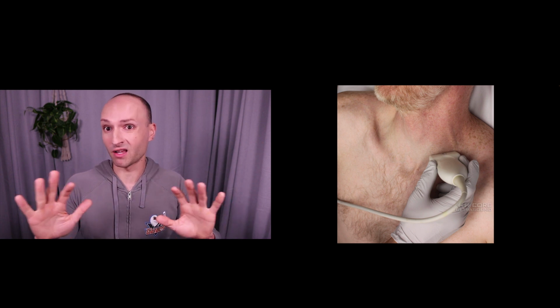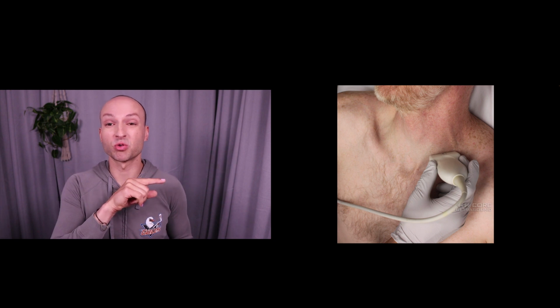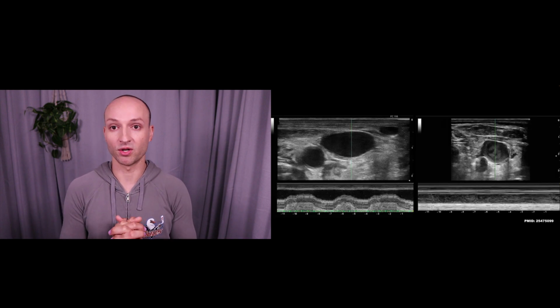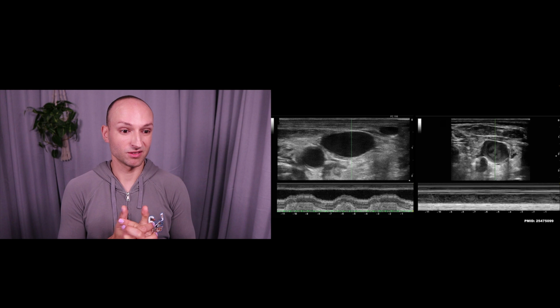There are some studies, though there's not a lot of studies by the way, but the majority of them say to look at the cricoid cartilage and go just lateral to that cricoid cartilage. One of them actually says to go 2 centimeters from the clavicle. Place it in cross section, transverse, and then stick that M mode cursor in there and just see what that collapsibility is with your M mode. It's pretty cool stuff.